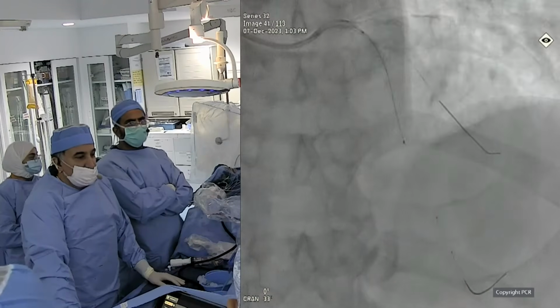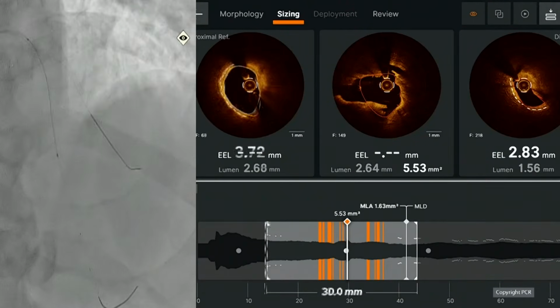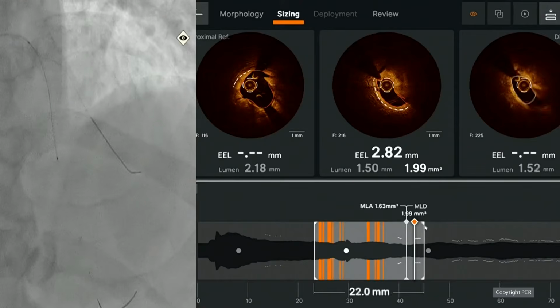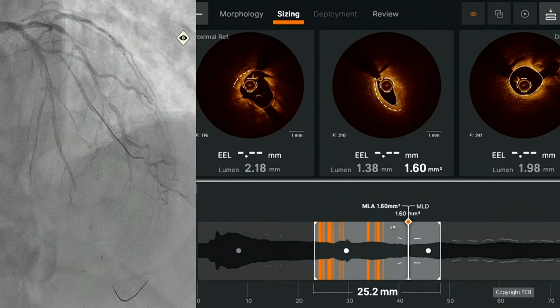Okay, show the OCT, please. Can you shift? Yes, you can see it now? Yes, thank you. Okay. Bandar, go to the distal landing zone. It is very important to show that we have this tiny white line. Inside, the fully black is the lumen, automatically detected.